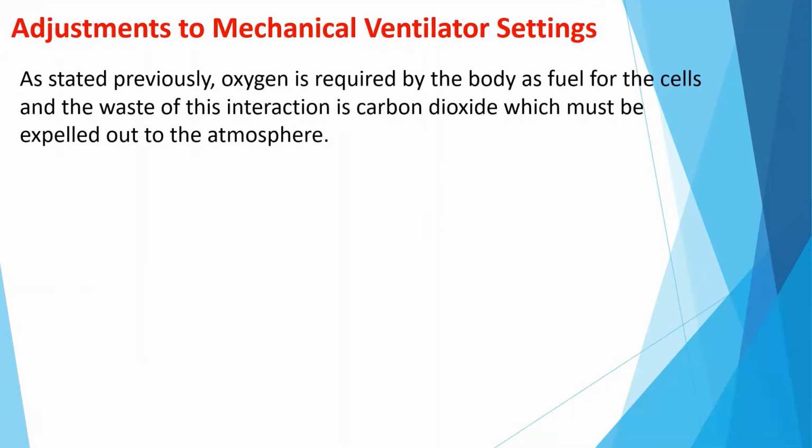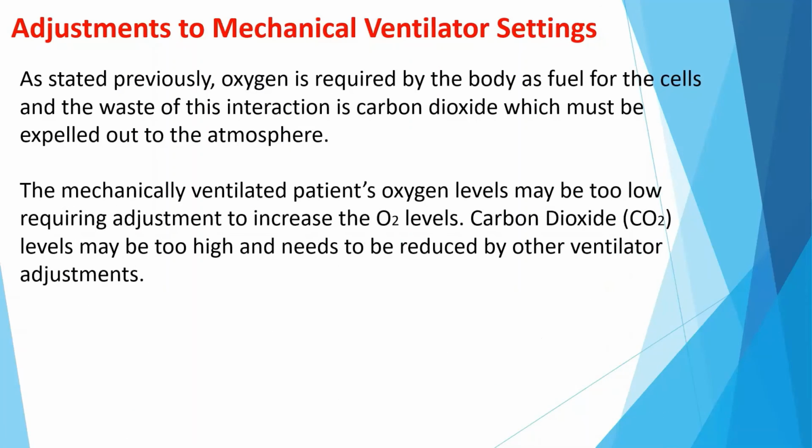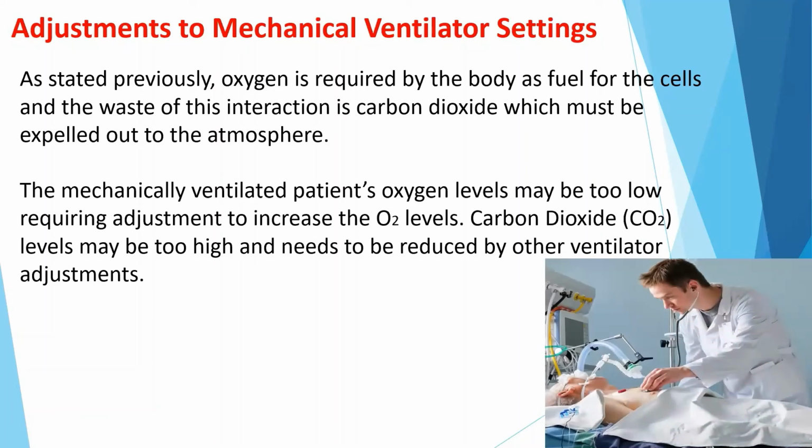As stated previously, oxygen is required by the body as fuel for the cells, and the waste of this interaction is carbon dioxide, which must be expelled to the atmosphere. The mechanically ventilated patient's oxygen levels may be too low, requiring adjustment to increase those levels, and carbon dioxide levels may be too high and need to be reduced by other ventilator adjustments.